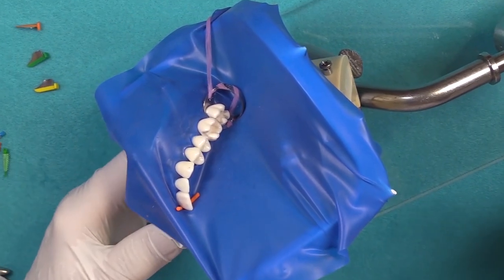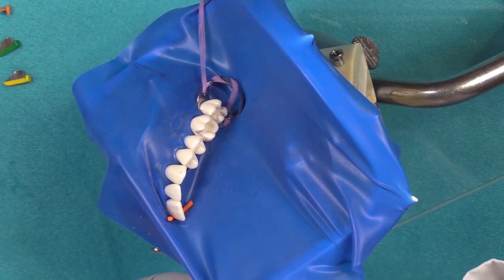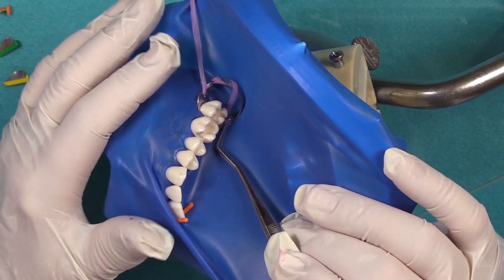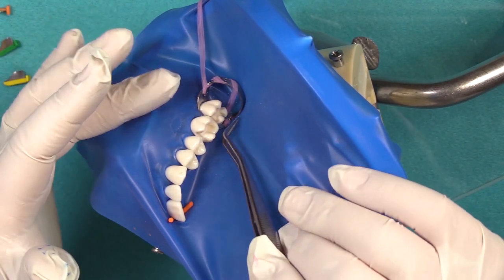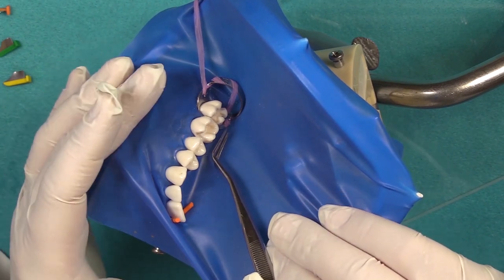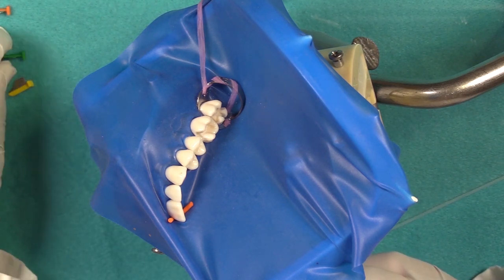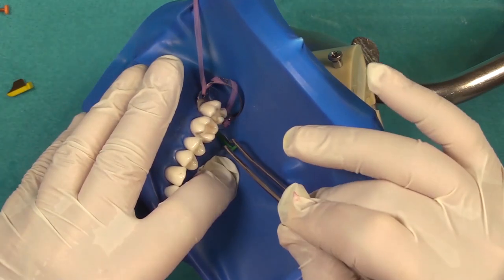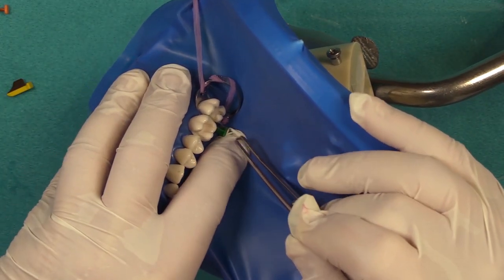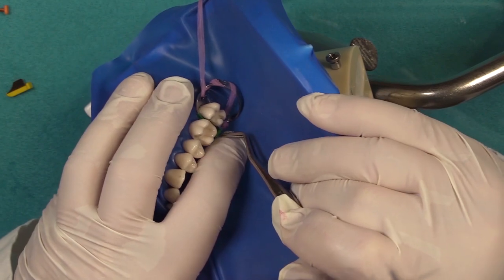I have here a restoration that was prepared on the last tooth in the arch. One thing that you would need to do is use a flat jawed clamp. The idea is to try to keep the clamp in place and restore the tooth at the same time. You want to place a fender wedge so that you're protecting the adjacent tooth, and at the same time it protects the dental dam from tearing. Make sure your wedge is secure in place.